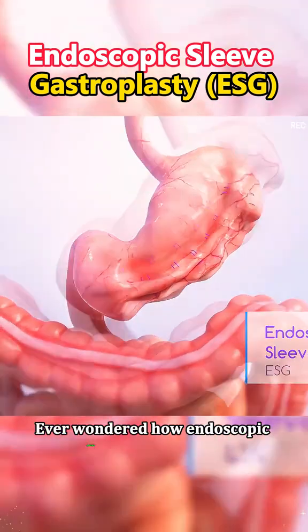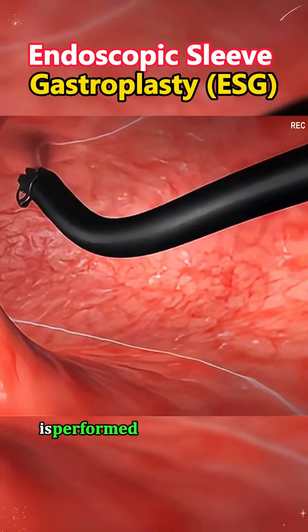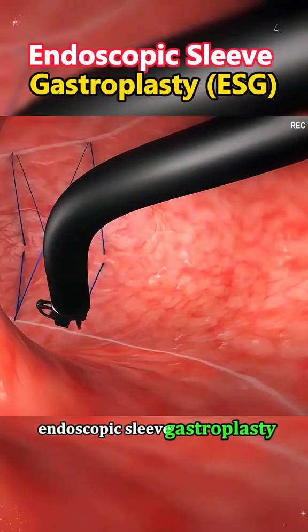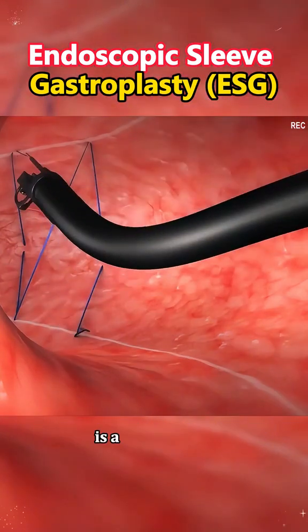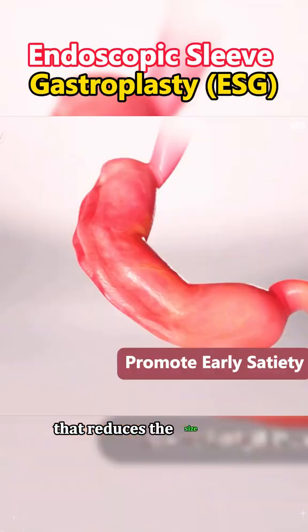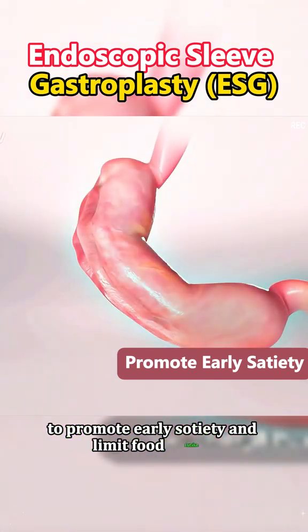Ever wondered how endoscopic sleeve gastroplasty (ESG) is performed? Let's dive into the process. Endoscopic sleeve gastroplasty, or ESG, is a cutting-edge non-surgical weight loss procedure that reduces the size of the stomach to promote early satiety and limit food intake.